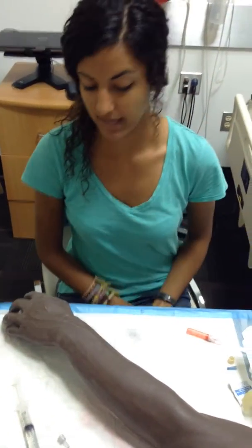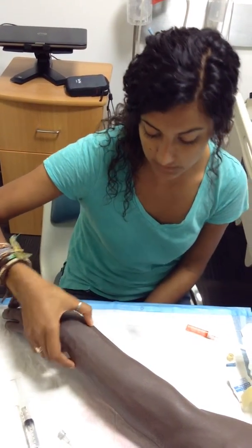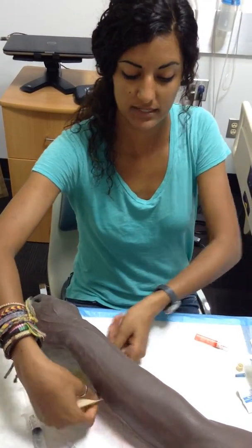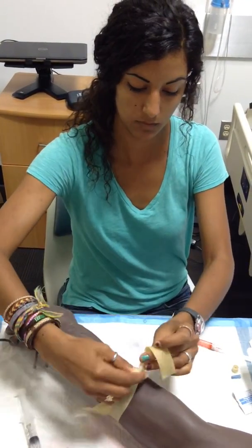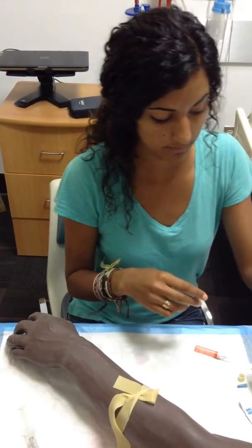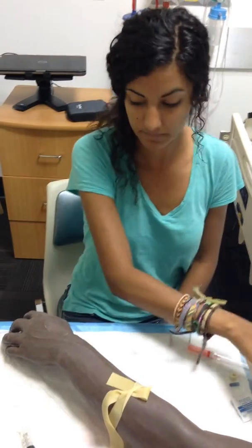Okay, so I come in and I wash my hands and I will look for a site, and this vein looks good to me. So I'm going to apply the tourniquet, and this can't stay on for more than 2 minutes. Nice and tight. Okay, and then the chlorhexidine, back and forth motion for 60 to 90 seconds.